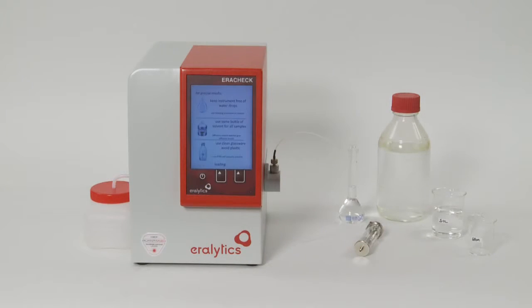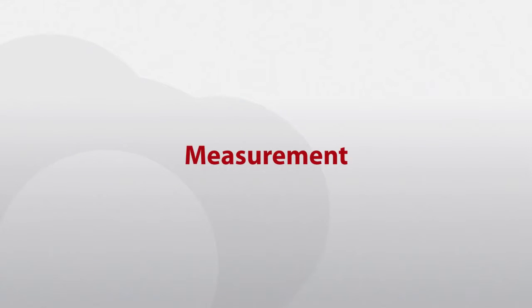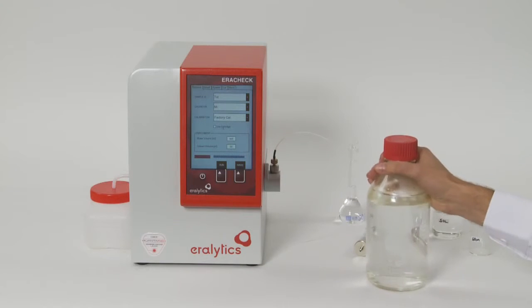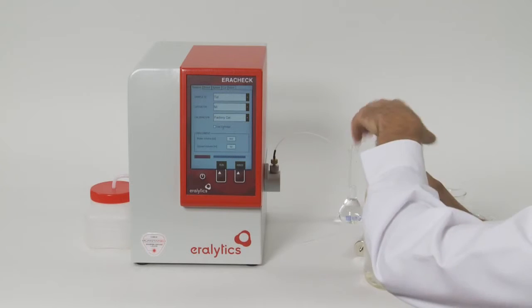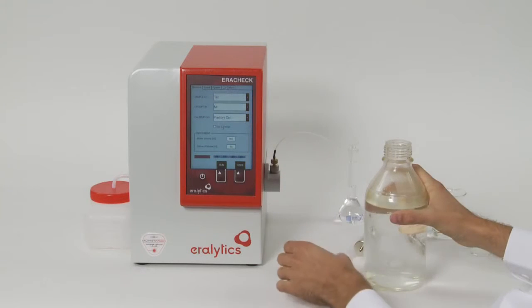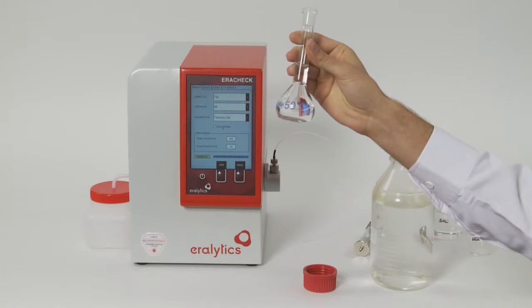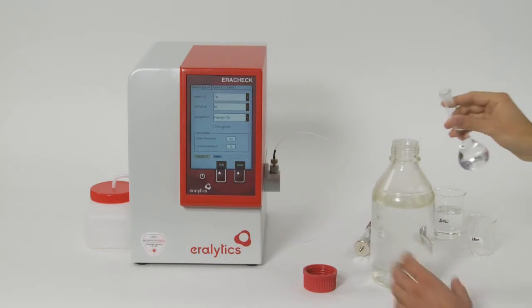In the first step of the measuring procedure, the hydrocarbons are extracted from the water sample. This is done by a liquid-to-liquid extraction using cyclohexane or cyclopentane as a solvent. We recommend collecting 900 millilitres of water sample into a glass bottle with a PTFE cap, and preparing 50 millilitres of solvent in a volumetric flask, then pouring it into the sample bottle.